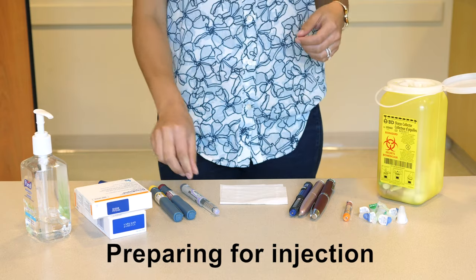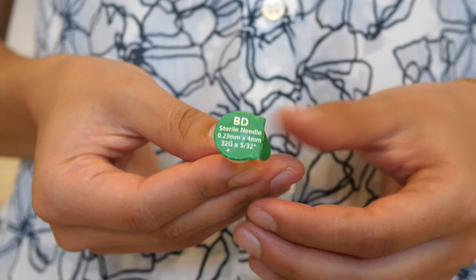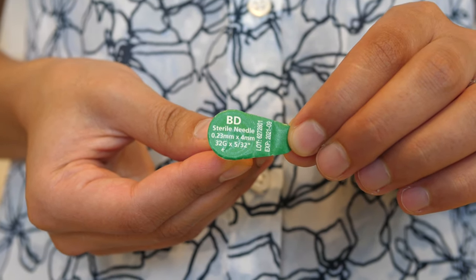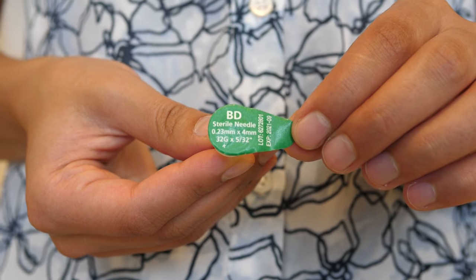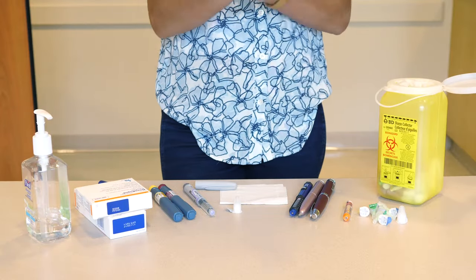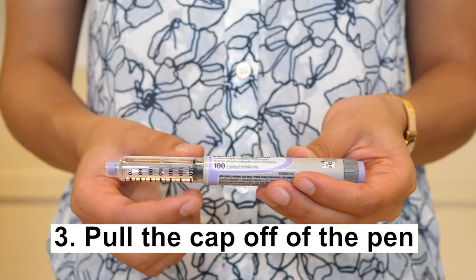To prepare for an injection, you will need your insulin pen and a pen needle. The pen needle should be a four to six millimeter needle. You will find the size of the needle on the tear-off tab on the pen needle. Use a new needle each time you inject. Wash your hands before preparing for or doing the injection to reduce your chance of getting an infection. Pull the cap off the pen and check to make sure there is enough insulin.